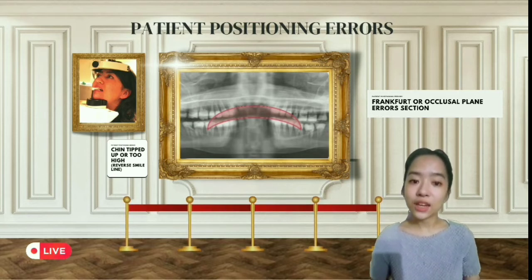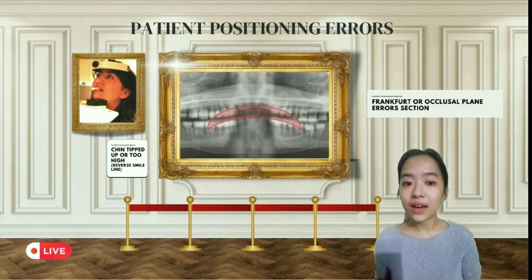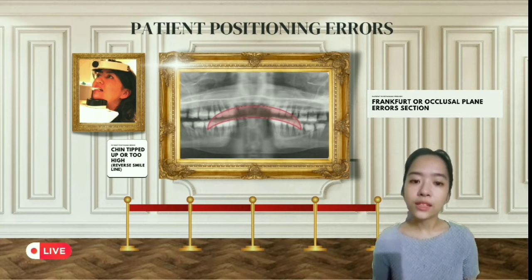To prevent such an error, the dental radiographer must carefully position the patient such that the Frankfurt plane, passing from the bottom of the eye socket through the top of the ear canal, is parallel to the floor. Again, we always go back to proper patient positioning.